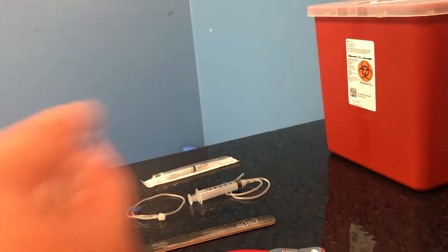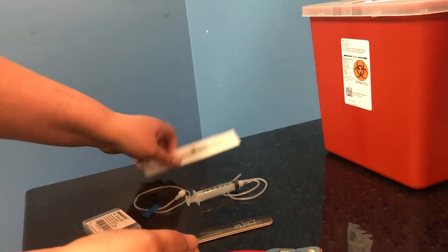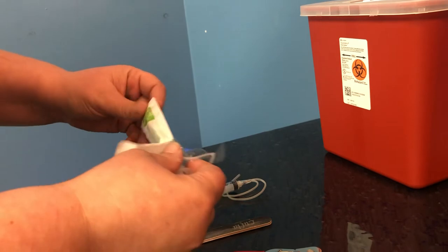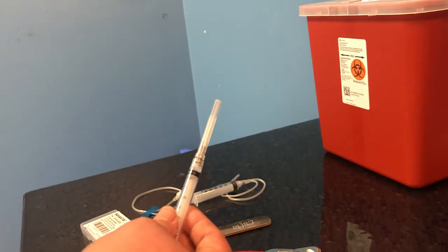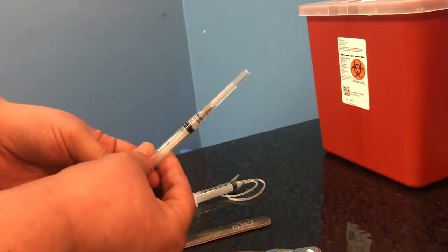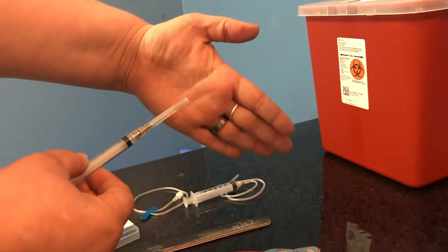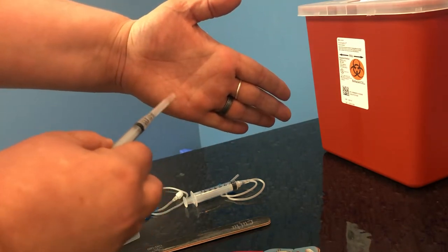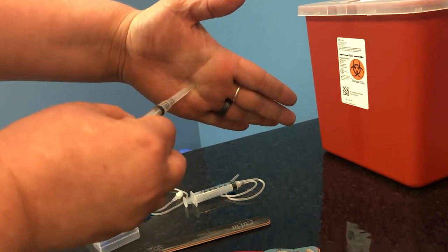Perfect. So when we work with training animals, one of the most common things that people will start with when they're doing injection training is a capped needle. And the nice thing about a capped needle is that it can't do any harm, so it's not going to cause any pain, but it's also not really going to simulate the needle sensation. So if I have a capped needle and I apply a little bit of pressure, we get this big surface area that gets triggered by that pressure. It's a relatively blunt stimulus.